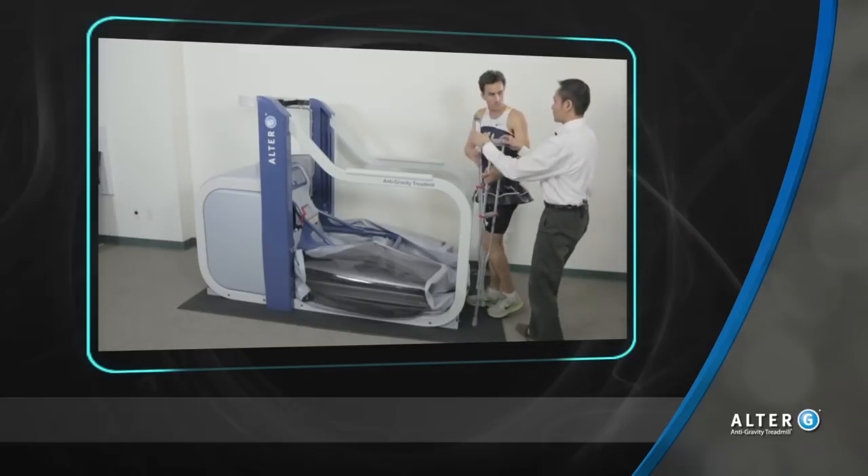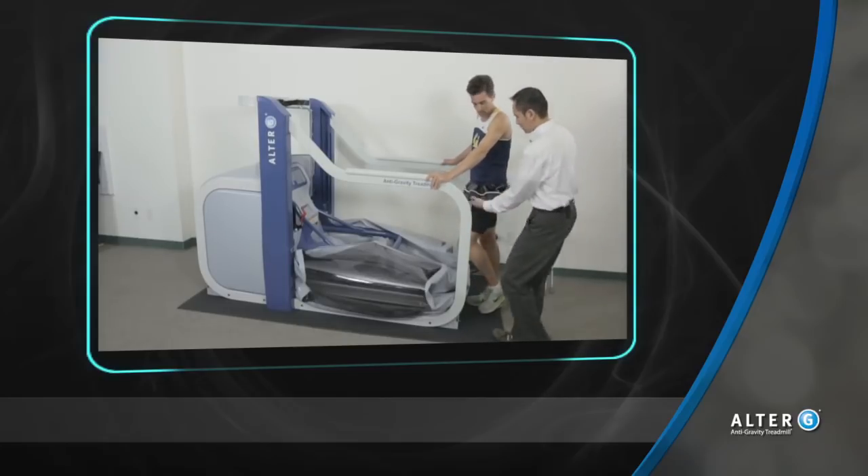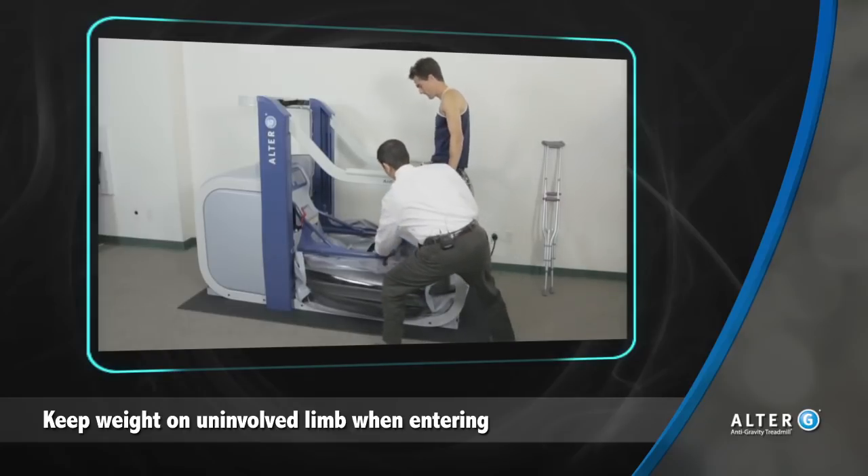Gone are the old methods with scales and sensation. Real-time weight-bearing status allows patients to rehabilitate and athletes to train like never before.